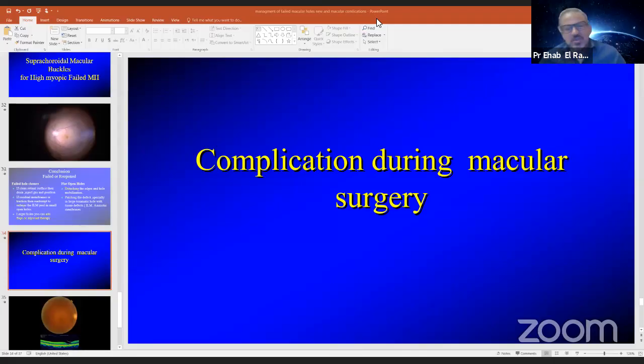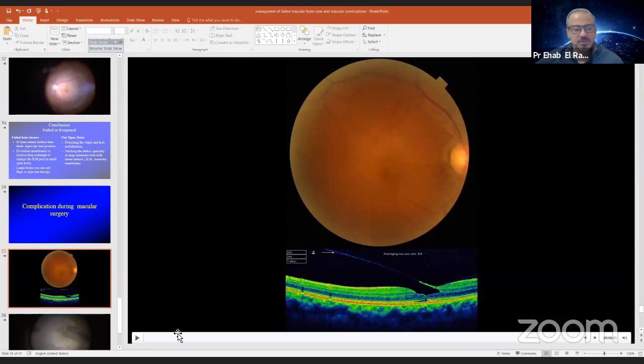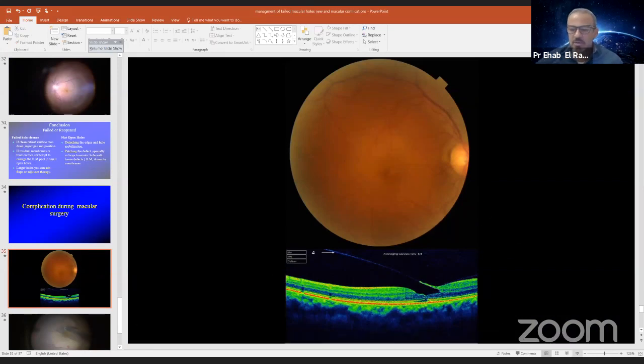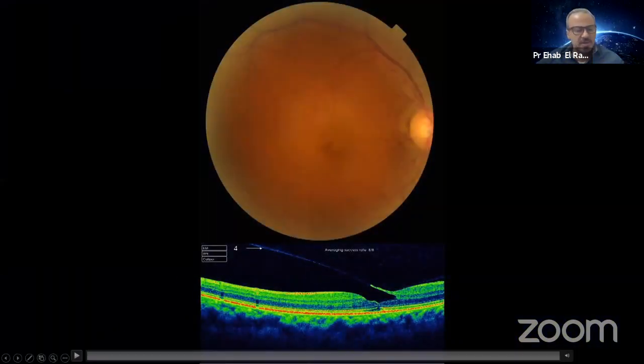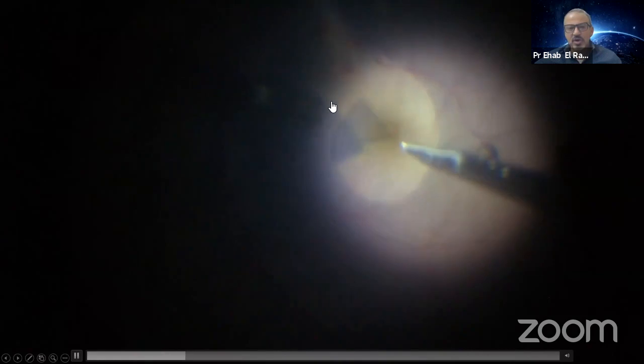Well, this part of the presentation is open for discussion while we're doing things. Now, we saw beautiful surgeries before, so let's see when things go wrong during surgery. This is a patient that had a macular hole, and you can see that during the surgery, I tried to keep it foveal sparing and leave the fovea till the last part. While doing the ILM peeling, I was trying to save the ILM over the hole right there. The extension of the ILM flap came to an uneven part right here, trying to keep this all as one piece. So one of the problems that happens is hemorrhage.